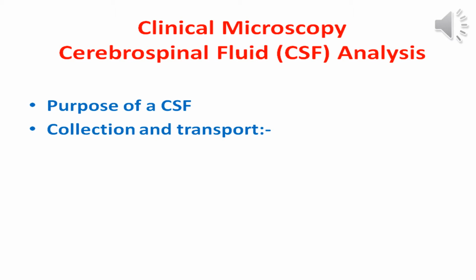For that, this sample is considered very precious and an emergency sample. When you have many samples in the lab, always analyze the CSF sample first, because it is considered an emergency sample. We always give priority to the CSF sample.